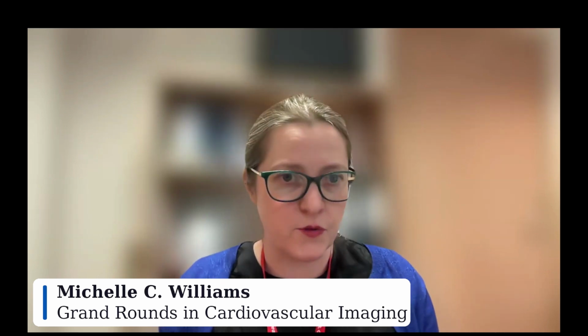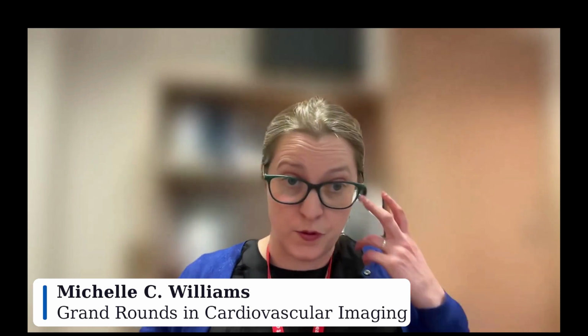Yes, although we have to think about radiation dose. We always want to do things as low as reasonably practical. And if a PET is not needed, then we don't want to do it. Even though we might get tiny radiation doses with oxygen-15 and the total body PET scanner, it's still an unnecessary additional test. So it's an option for patients, if optimal medical therapy is not working, to do a PET scan to help guide other things. But CT is a reasonable starting point, I think, and then do other things as required.